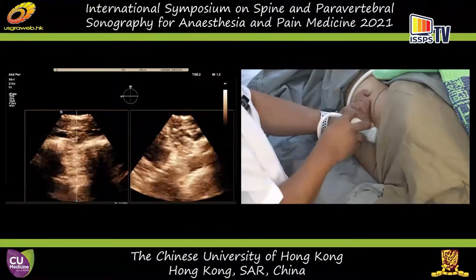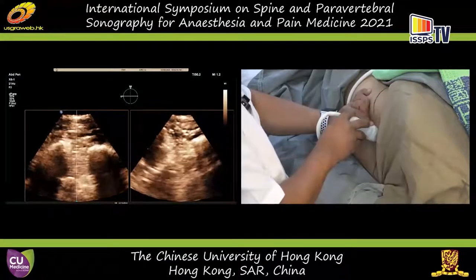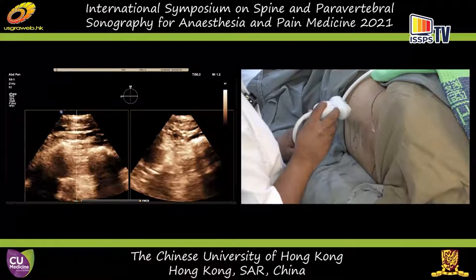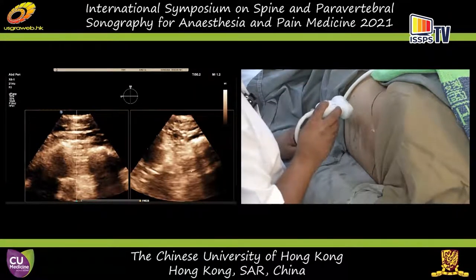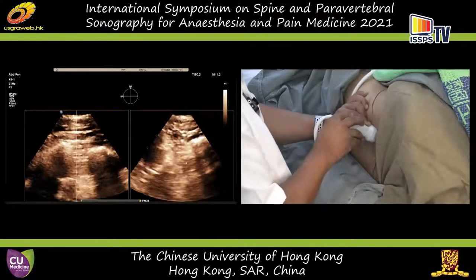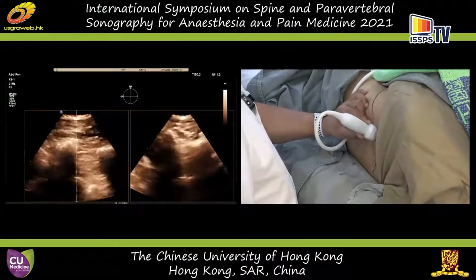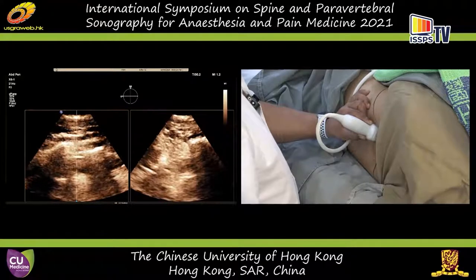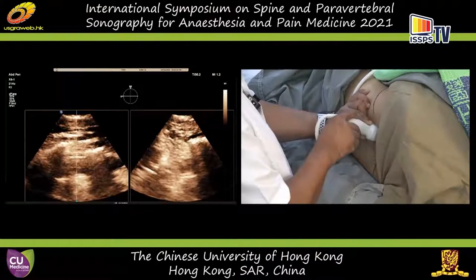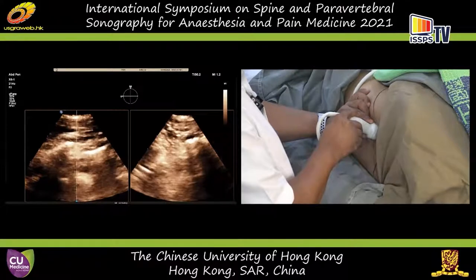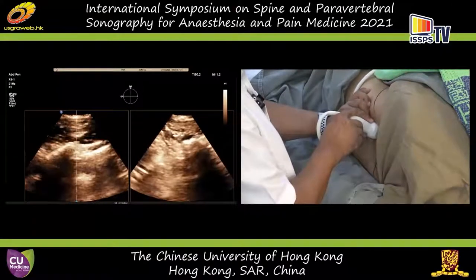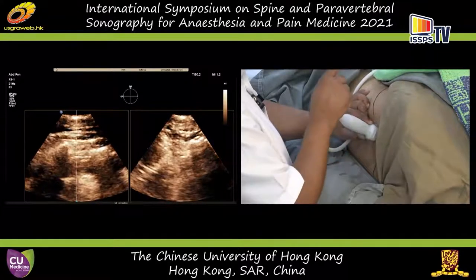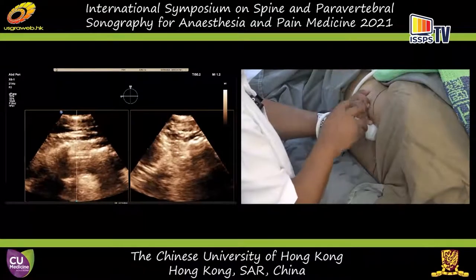On the image on your right you can see half of the thecal sac. You can see the dura — posterior dura — and the epidural space posteriorly, and the anterior dura is more anteriorly. That is the biplanar view. If you insert a needle under real-time ultrasound guidance, you can use the image on your right to track the needle as it comes in the transverse view. In essence, you can see the needle both out-of-plane and in-plane simultaneously. The limitation is that the out-of-plane view will only appear when your needle touches that line delivering the transverse view.